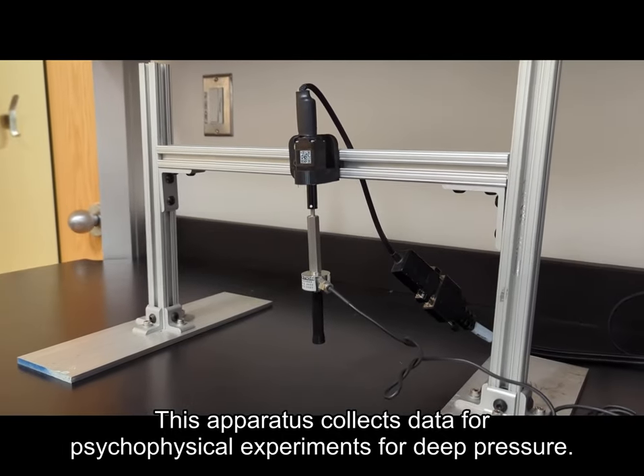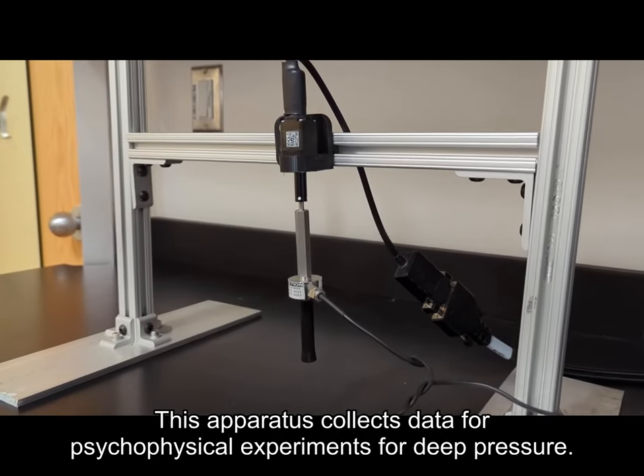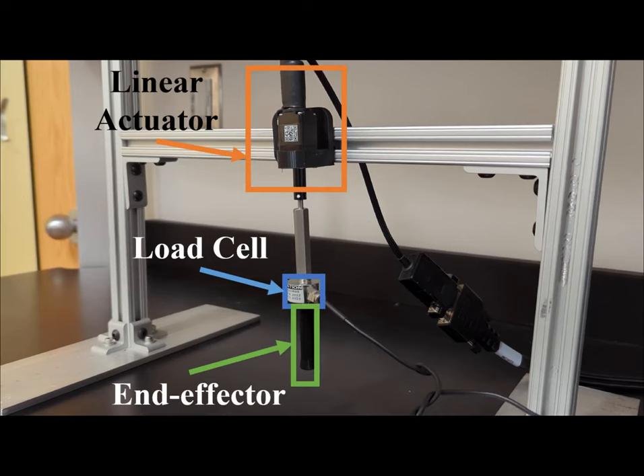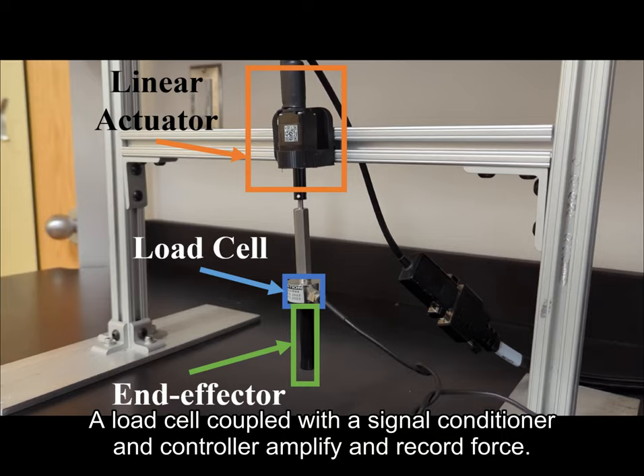This apparatus collects data for psychophysical experiments for deep pressure. A linear actuator and end effector exert force over a specified area. A load cell coupled with a signal conditioner and controller amplify and record force.